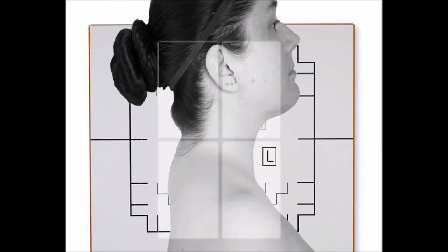The first projection I will demonstrate is a lateral view. Rotate the patient so that the left shoulder is against the bucky. Align the mid-coronal plane with the midline of the IR.